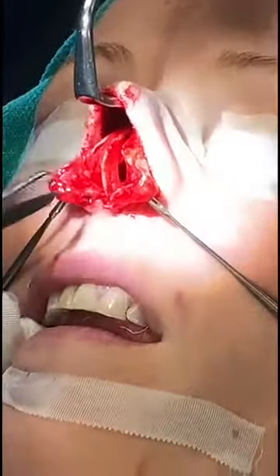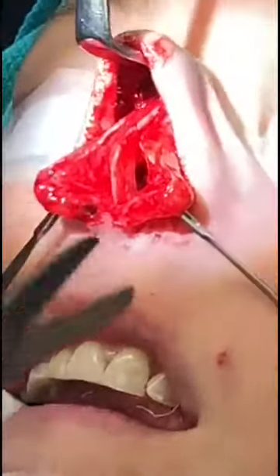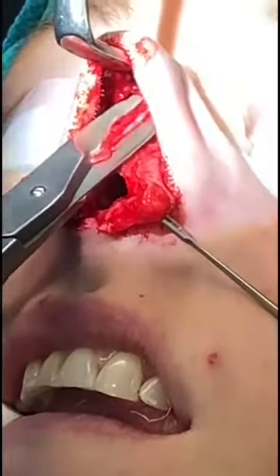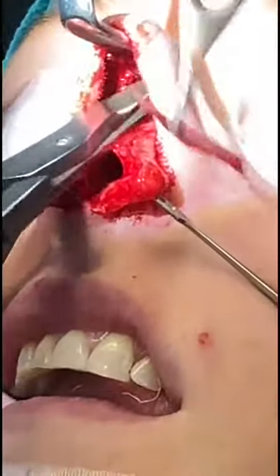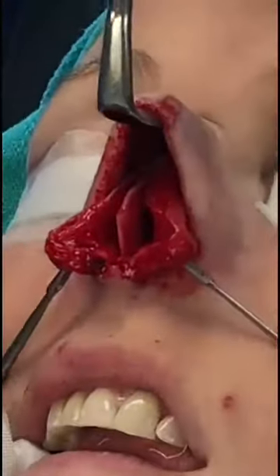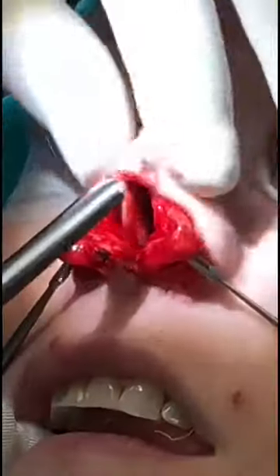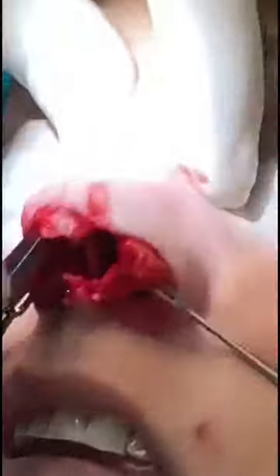So we've dissected out the septum — it's a little bit straighter in the end, but it's still being held crooked by the structures up above. So we're going to start by taking down some of her bump. We use that to take down the cartilage, then we'll take a rasp and start to file down the bone, taking it down a little bit at a time so you get it just where you want it.